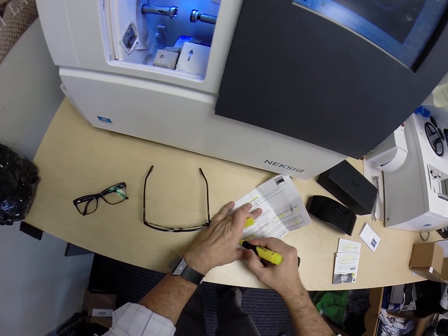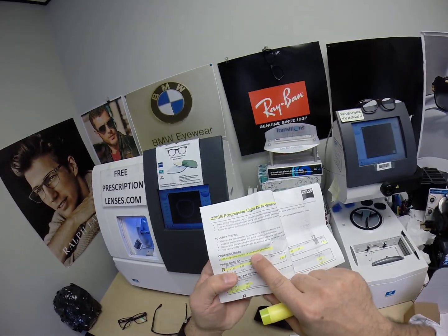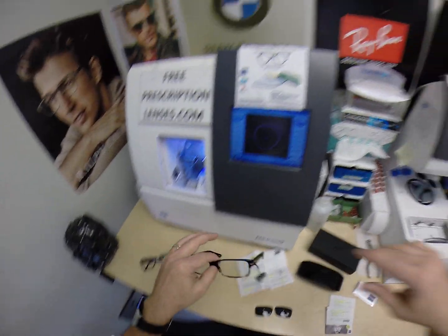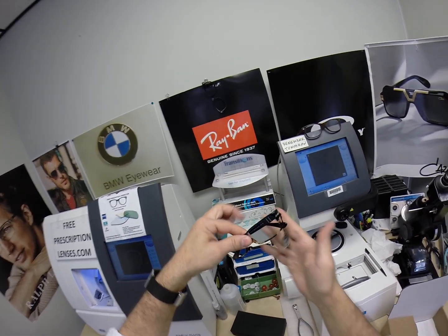The progressive Light D, 1.59, which is the refractive index of polycarbonate, Photofusion blue. So this is what they look like clear. One last note, well, I'll get to that later. I'm going to go ahead and activate them.